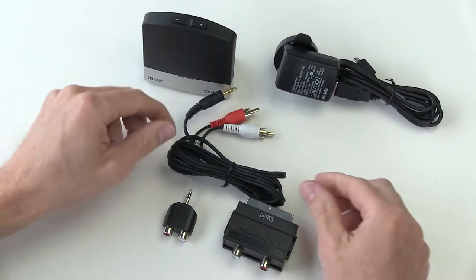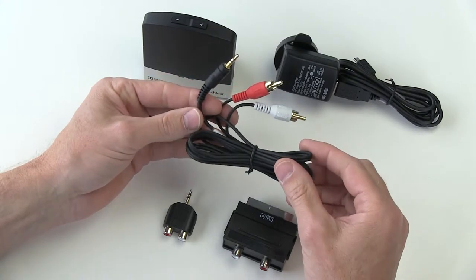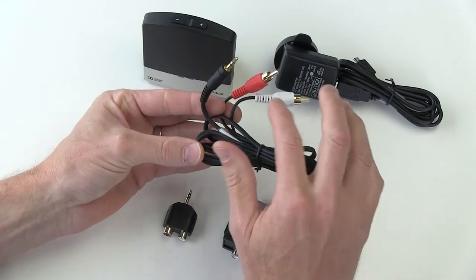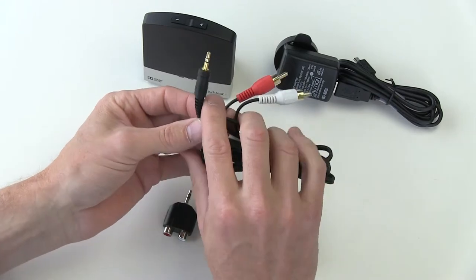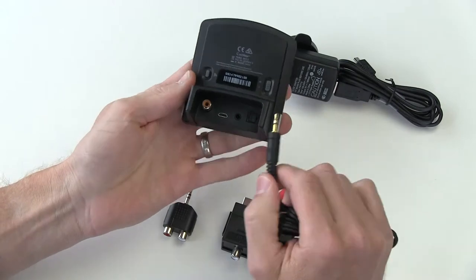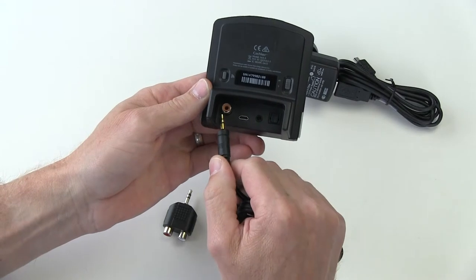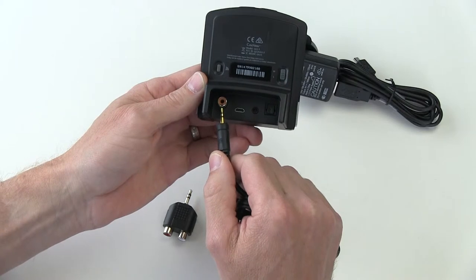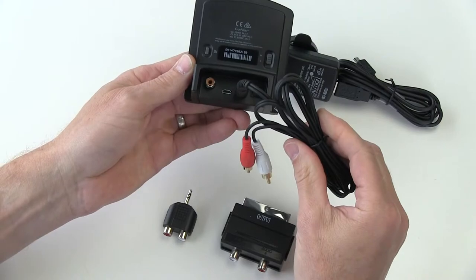Once you've got power, you need to connect the TV streamer to your audio source. You would start using the analog audio cable, which is the one with the red and white adapters that go into the audio source, and the black and gold one that goes to the back of the TV streamer and connects to the analog port here. It looks like it might fit into the coaxial adapter plug, but it's actually meant to go into this plug here. Now you're ready to set up to the TV.